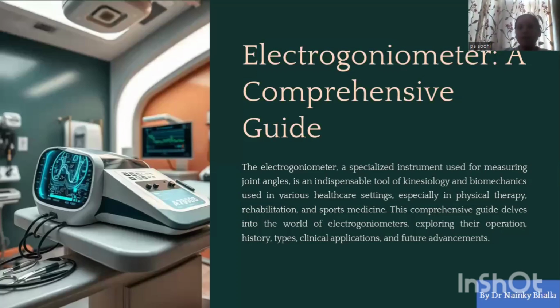The topic today is Electrogoniometry. We are basically dealing with kinesiological tools for assessment of functional movements in biomechanics. And one of the tools we use nowadays is electrogoniometry.